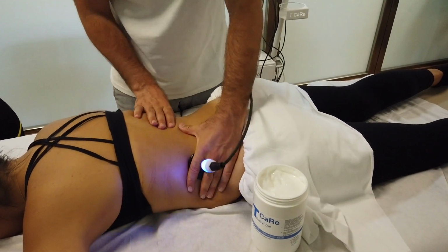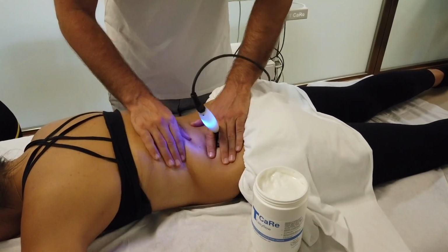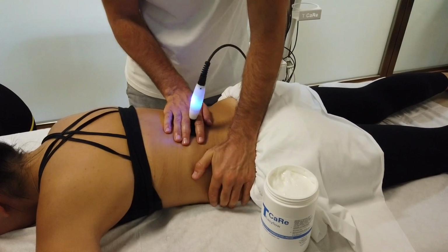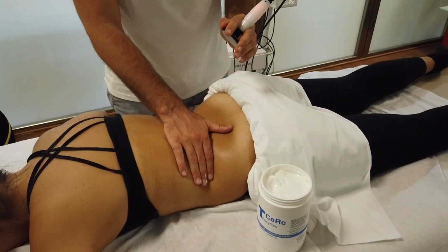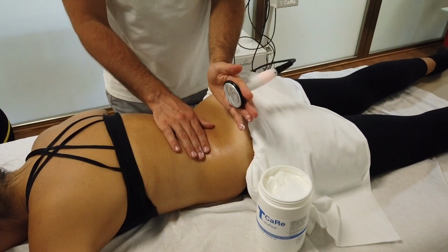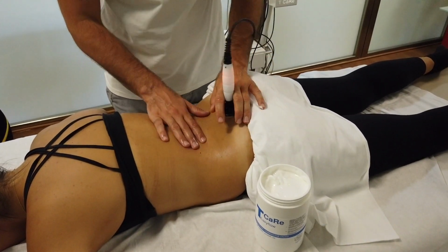So I can choose different modalities of manual treatment: massage, mobilization, and treat all the surface of the muscles. After 10 minutes of capacitive treatment, I change to the resistive electrode and I start the treatment.